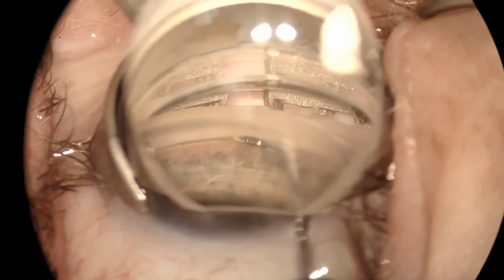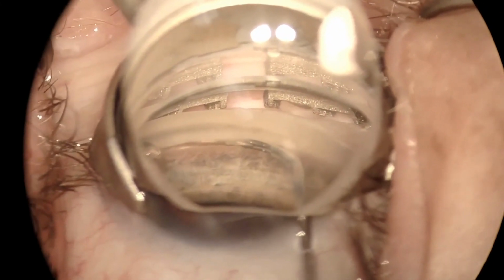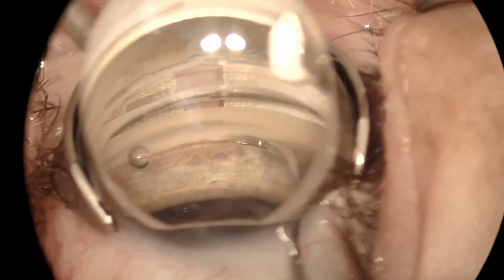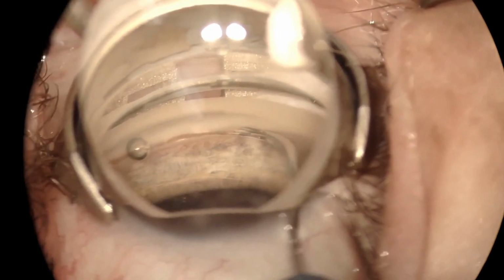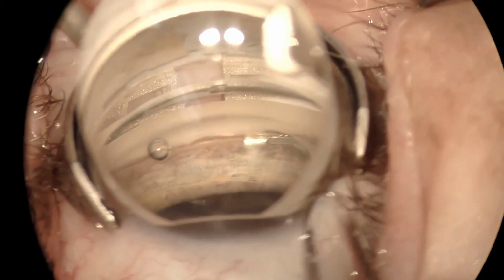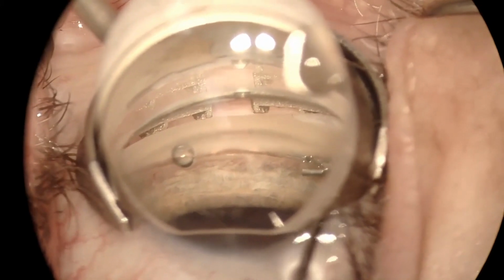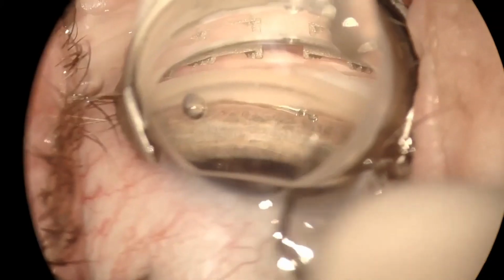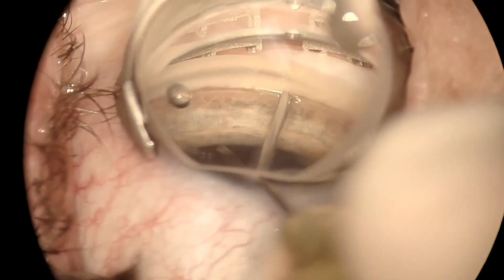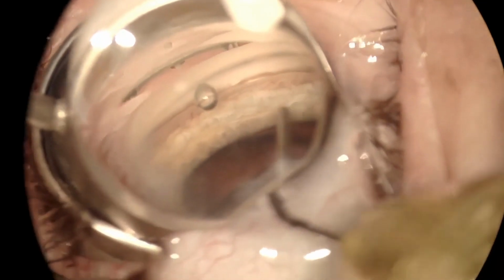I've got it angled about 15 degrees towards the cornea so that the stent deploys in the proper position. Again, if it's parallel or slightly posterior tilted, it can make the stent go posterior, which you don't want to do. As the video plays, you can see you just gently enter the trabecular meshwork enough to puncture it, and then I'm gently wheeling the stent down, and once it goes in, it'll actually expand the canal a little bit.